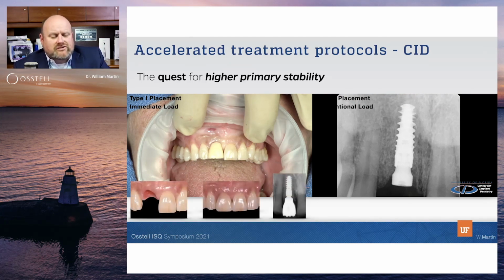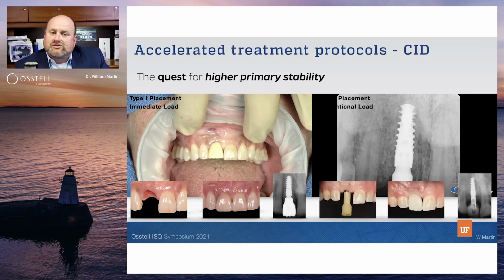Fast forwarding to accelerated treatment protocols and outcomes, you can see the patient on the left there. She had a restoration. It was an immediate load, so we brought her back in 6 to 8 weeks, where we moved forward with the definitive restoration. Tissues were shaped at that point.